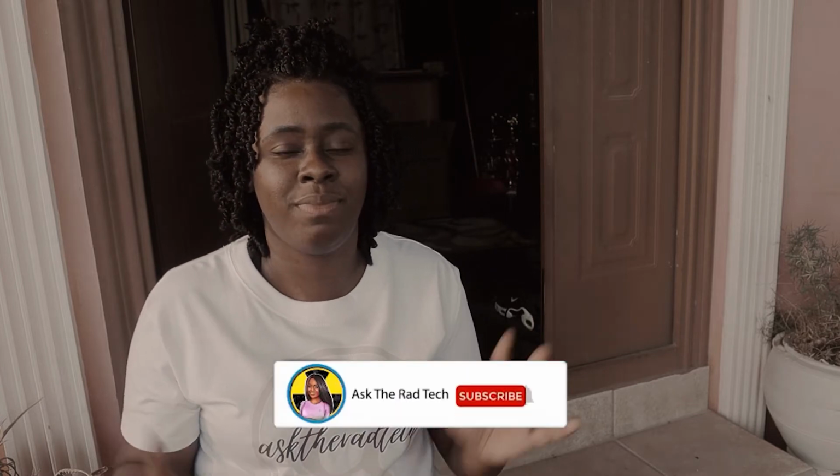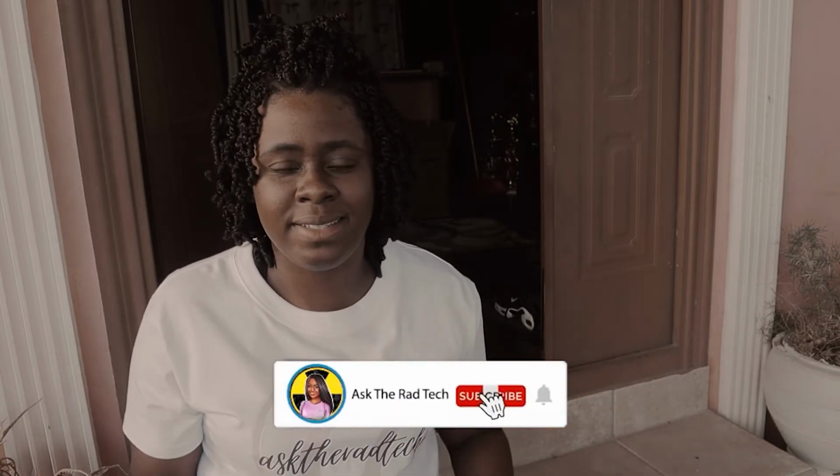So I have the patient lying down, and I'm gonna have a little pop-up video of me literally showing my hips. I'm wearing pants, obviously. I'm not gonna bare it all on YouTube or for anybody just like that, right? But I'm giving you all a general idea. Now the positioning for a hip, you need the patient to be supine, lying down flat on their back.